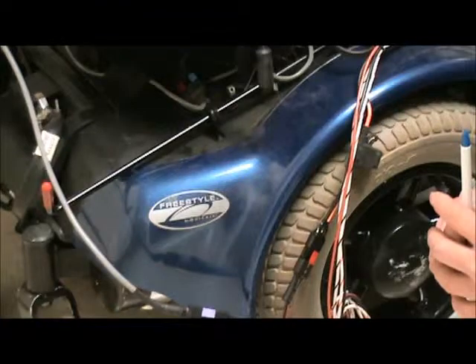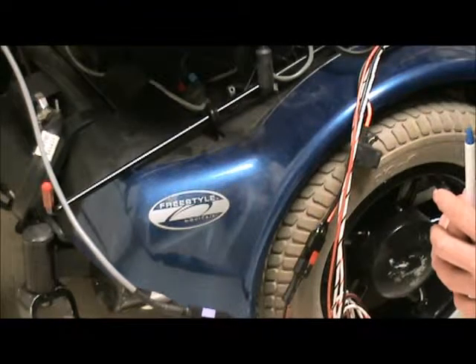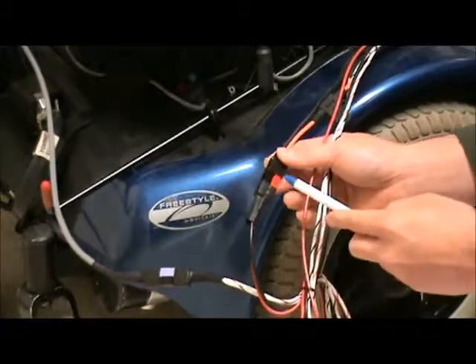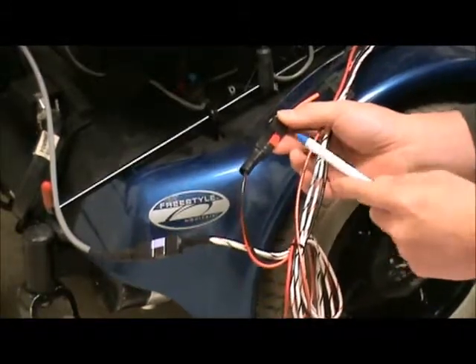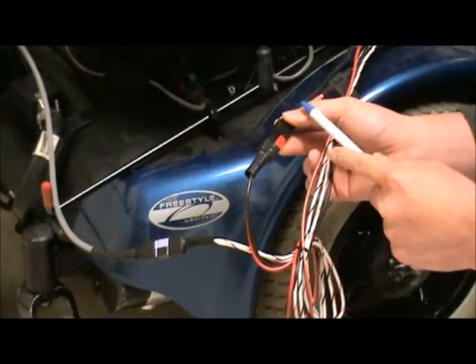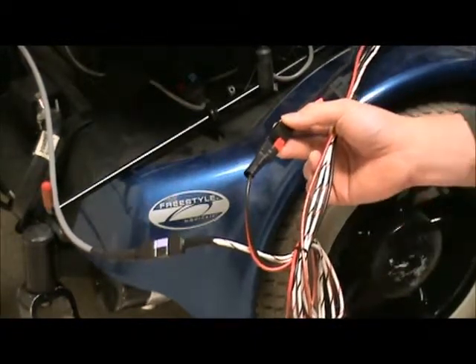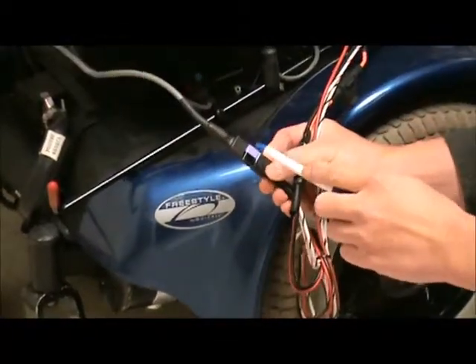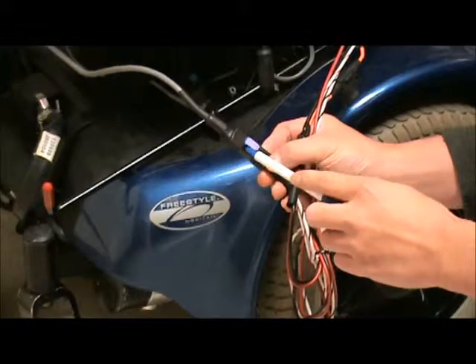If the switch is fine, the next step is to check the Anderson connectors. Start with the red and black connector — make sure the red goes to the red and the black goes to the black. Then check the purple and black connector — make sure they're connected purple to purple, black to black.